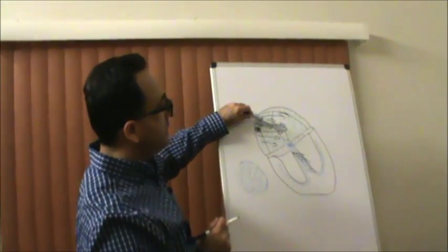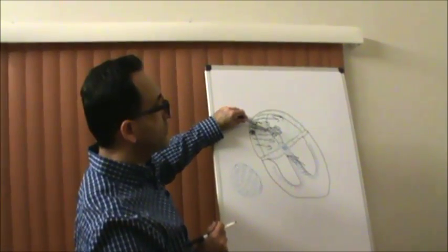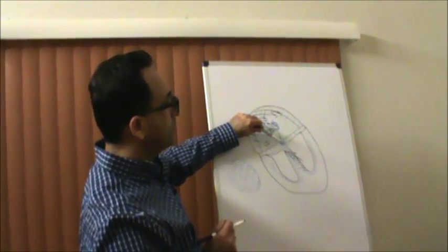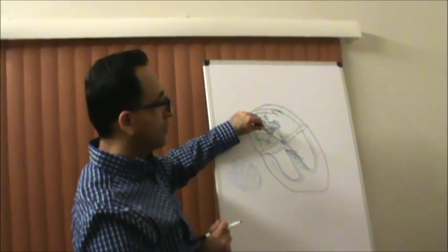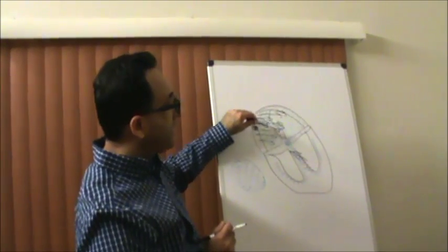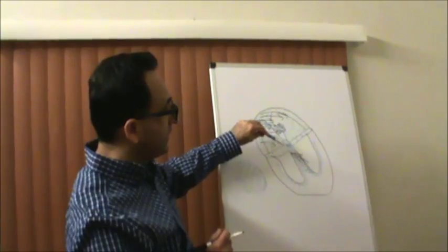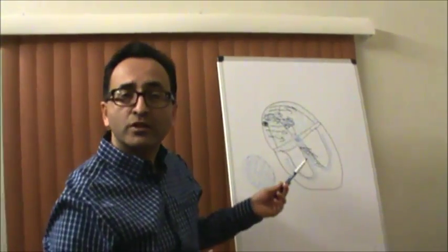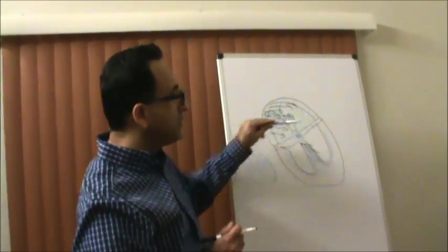So this one is SA node fires, depolarization of both atria. The stimulation of the AV node is silent. Nothing gets noticed on the electric paper or our ECG tracings. Then through AV node, through bundle of His, it goes through the left and right bundle branch, and through the Purkinje system, the fiber, it gets into the ventricles.